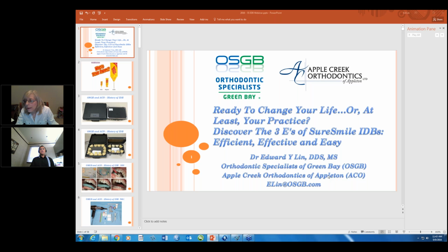Okay. How do you handle a bracket coming off mid-treatment? Do you direct bond that bracket? Yes, we direct bond the bracket, and that's how we've always handled it with all of our SureSmile cases. But because you're living through the cloud, you'll have your user ID and password. You can always pull up the patient case, and you can look at where that bracket is positioned on the digital model, and that's what we actually have the assistants do for us. So before we come back to reposition brackets, they'll have that pulled up for us. We're still orthodontists, we've got to figure out where to put things.